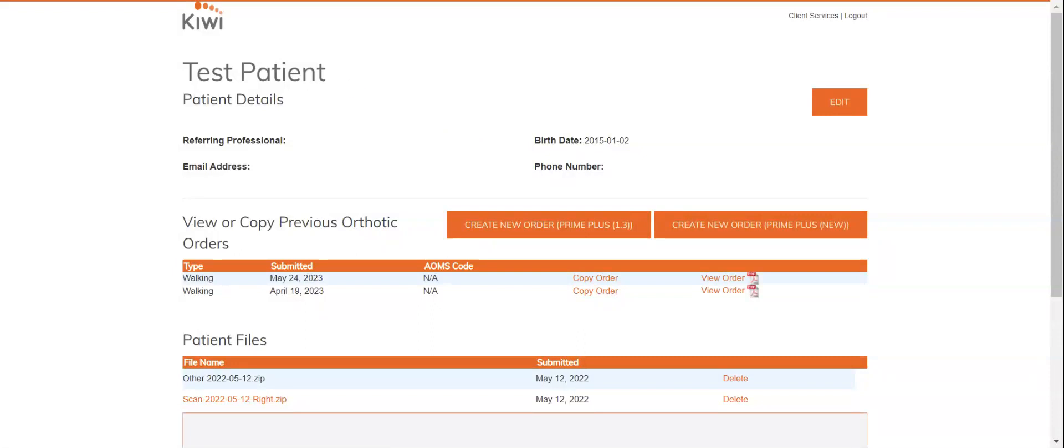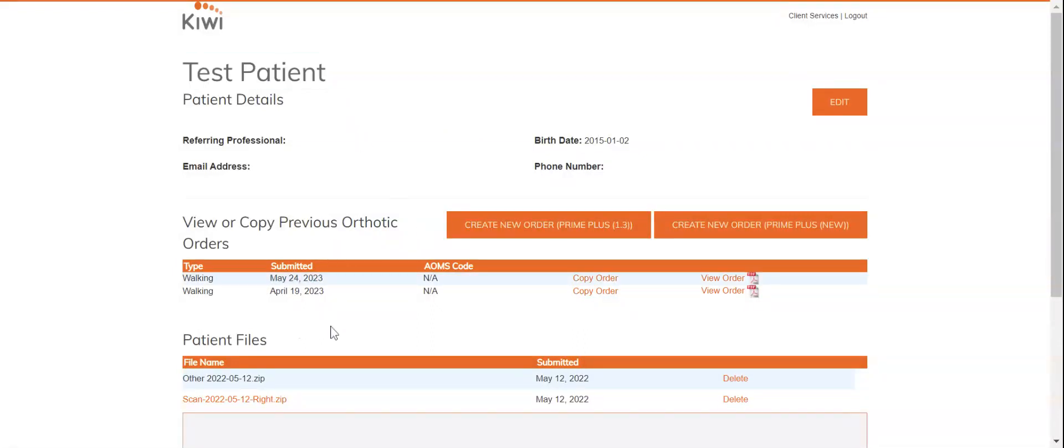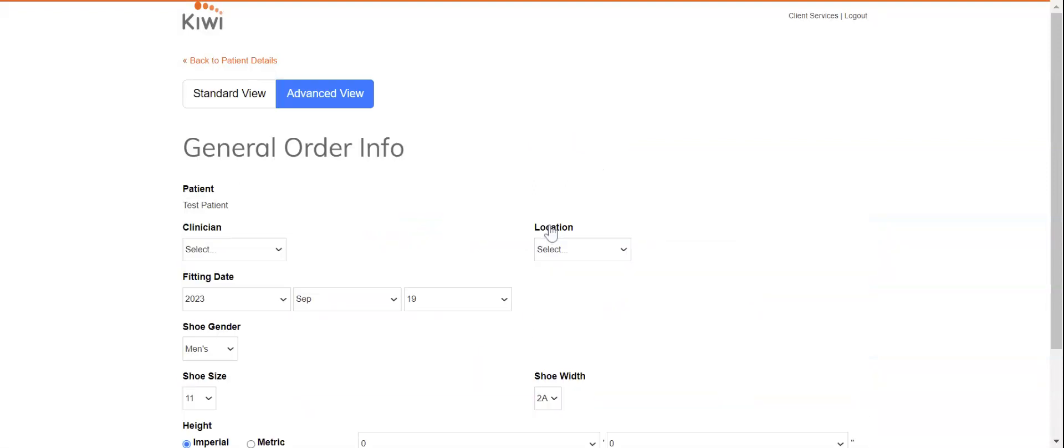You can see I've pulled up just a test patient here and you can see some of the previous orders and files that have been uploaded, but we'll just be hitting create new order there.